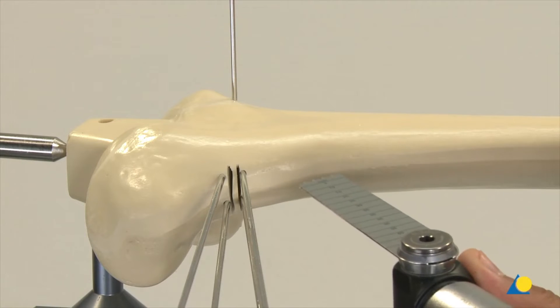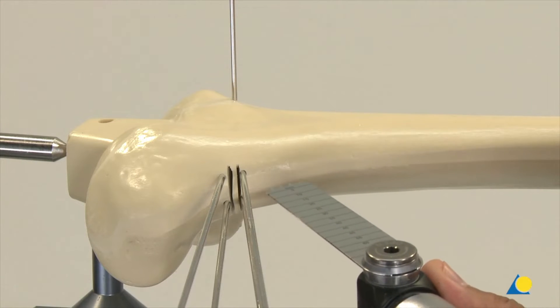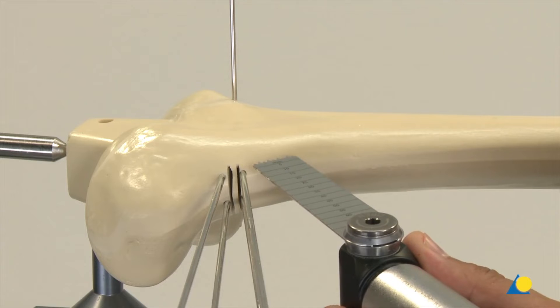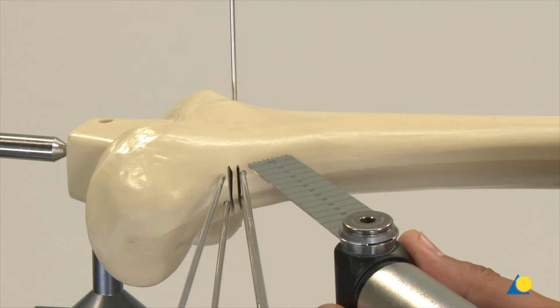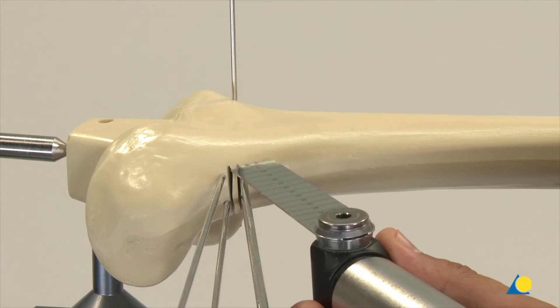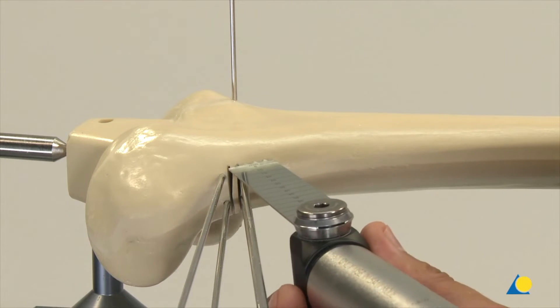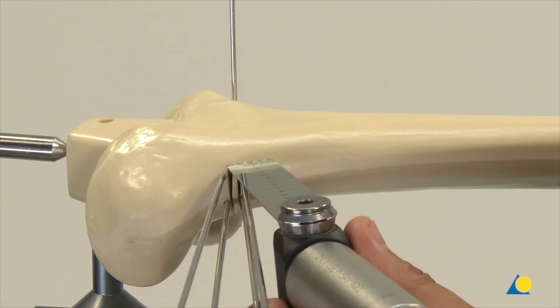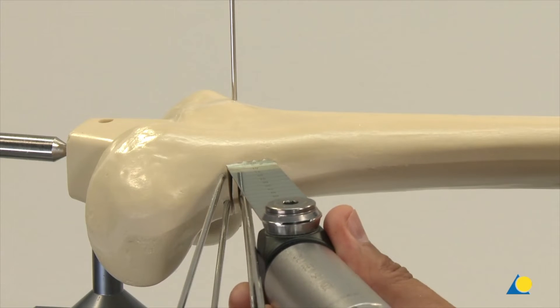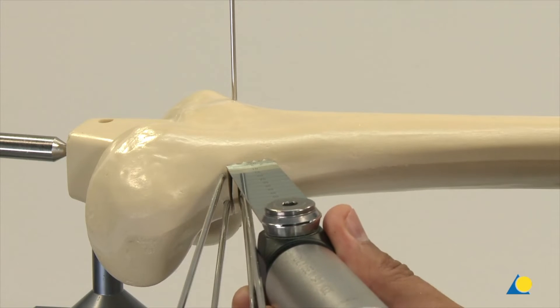To make the ascending osteotomy cut in the ventral quarter of the bone, a thinner saw blade is used. The soft tissue is protected with the Langenbeck soft tissue retractor, and the saw blade is cooled constantly.